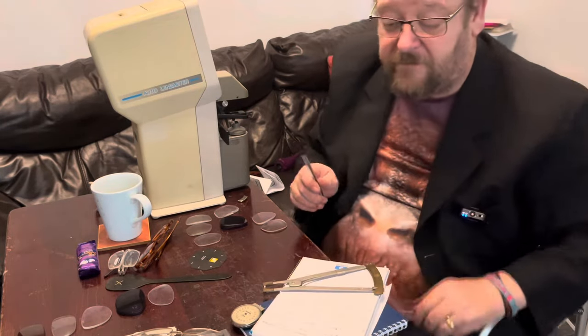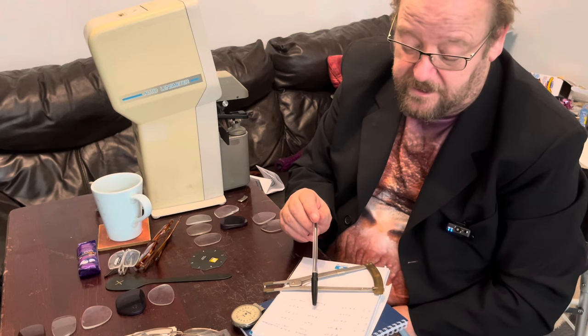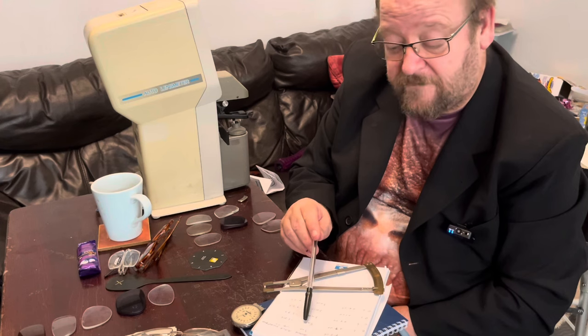So I've measured the first five lenses. The thinnest lens of all is two millimeters in the center thickness, with the thickest lens in the center thickness being five millimeters.